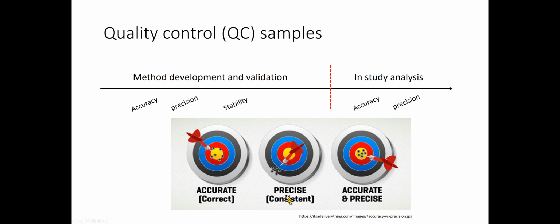You should prepare any calibration standards and QCs from separate stock solutions. However, if you can demonstrate the precision and accuracy in one validation run using calibrators and QCs prepared from separate stock solutions, then you can use calibrators and QCs prepared from the same stock solution in subsequent runs. You should make up calibrators and QCs in lots of blank matrices that are free of interference or matrix effects.